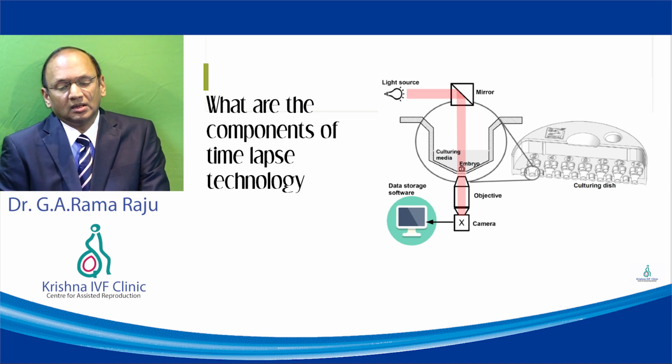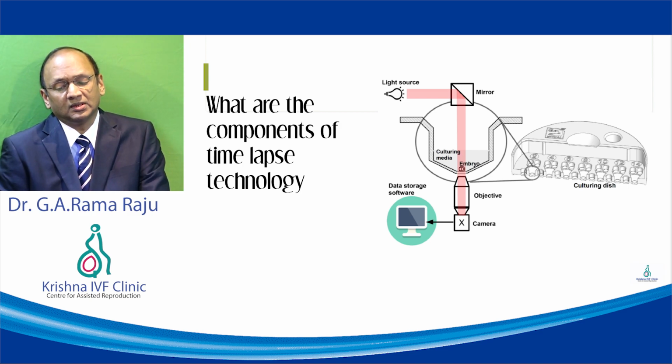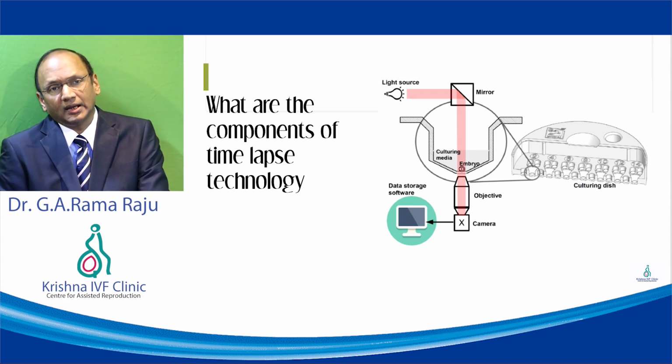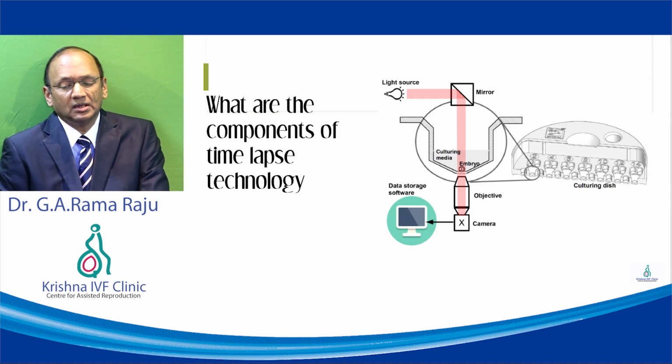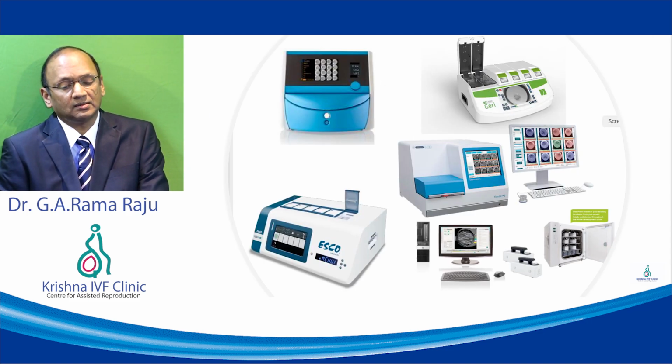Second thing is, what is the type of the wells that are there and how expensive they are, and for how many of your patients each incubator is needed, and that should be looked at, because in anxiety and in a hurry sometimes we buy a time-lapse system technology and then realize it is not adequate or not fulfilling our requirements. So looking at all these parameters is important.